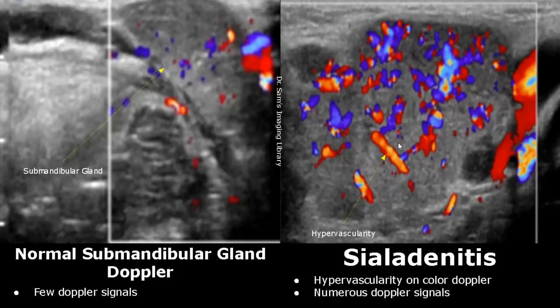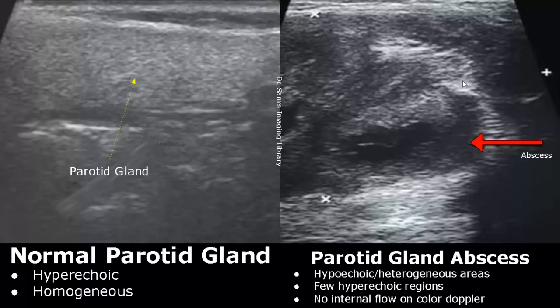In a parotid gland abscess, we will find hyperechoic and heterogeneous areas, along with some hypoechoic areas. We will not see any internal flow on color Doppler — no color flow will be seen inside the abscess.